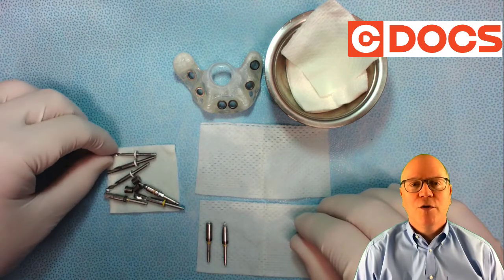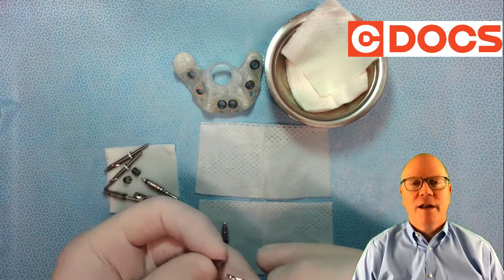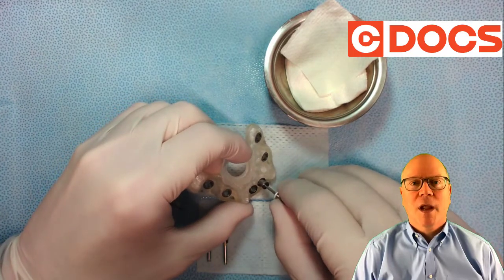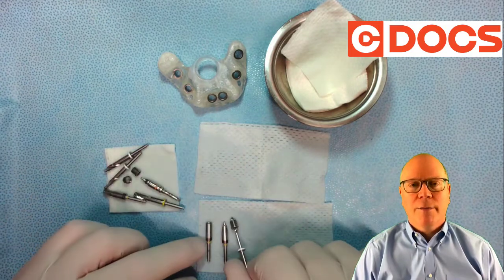Now I'm going to take the number one drill, and I'm going to get the sleeve that matches that, have that all set up — and I'm doing all this while the patient's getting numb. So we double check that, check it with the guide, and put that in the alignment there.